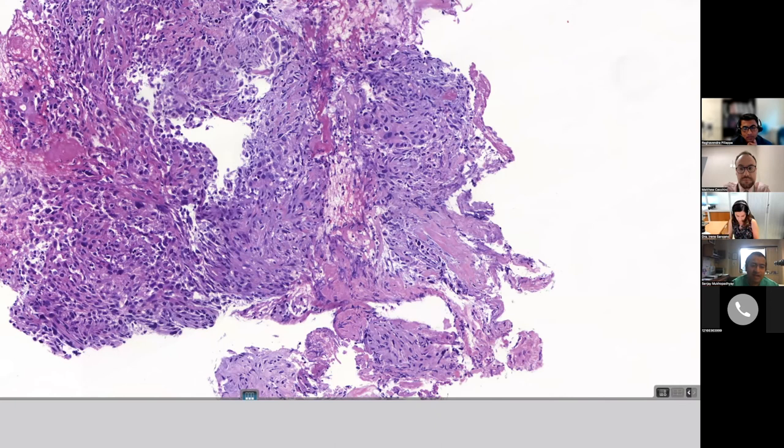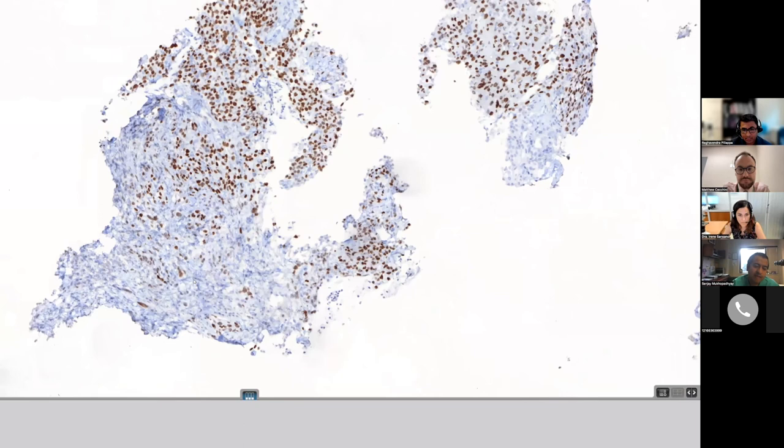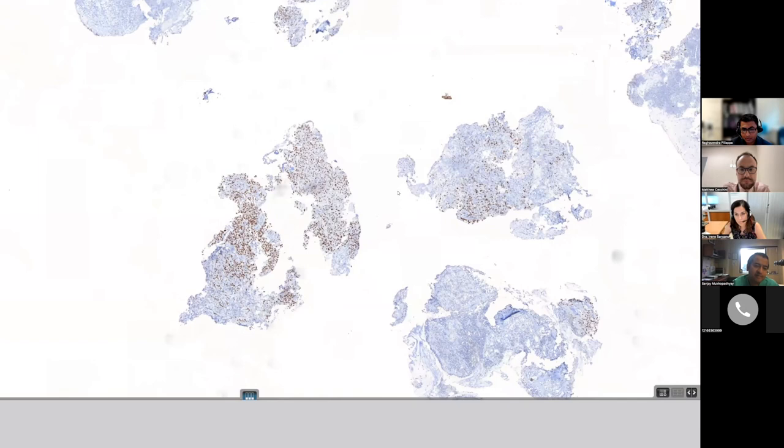The other point I wanted to make: when I have sarcomatoid features or I'm thinking sarcomatoid, I always add a pan-keratin to see if those cells are staining with keratin versus desmoplastic spindle cells or fibroblasts, which would not be keratin positive. That way I'm trying to match whether the same cells are positive for keratin, to make that comment or at least raise the concern for sarcomatoid differentiation, especially on the needle core biopsy. But otherwise, when TTF1 and p40 are both negative, I do exactly the same as Sanjay said.